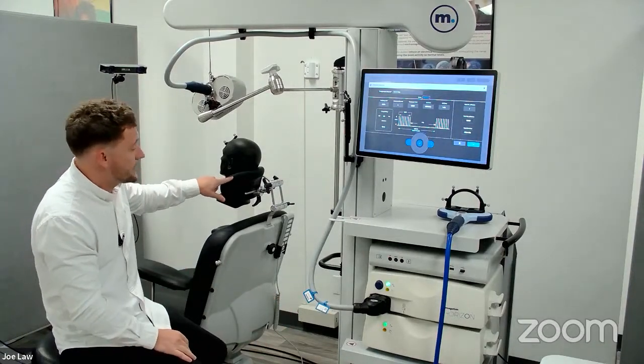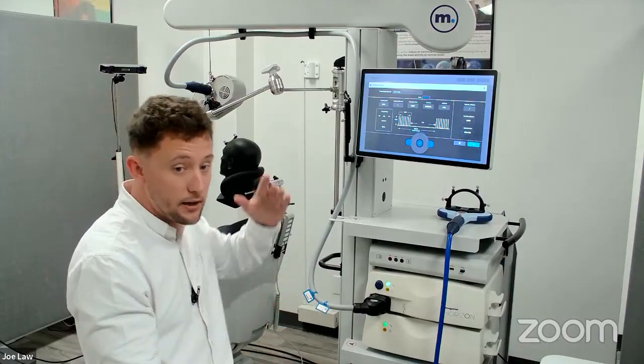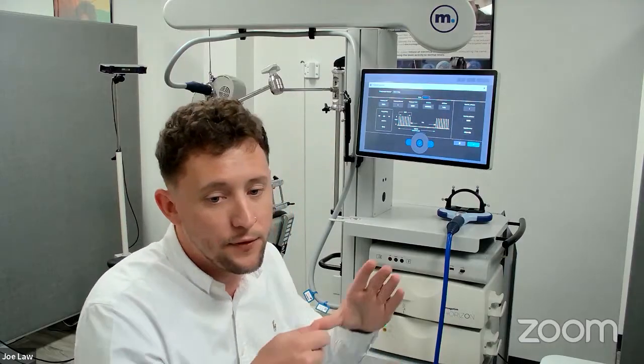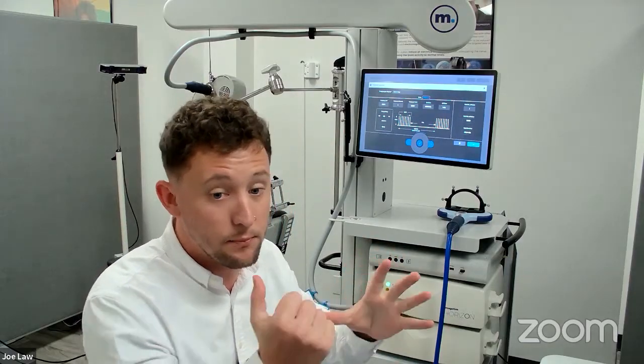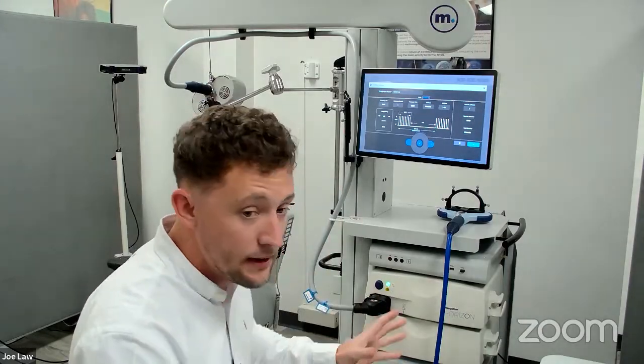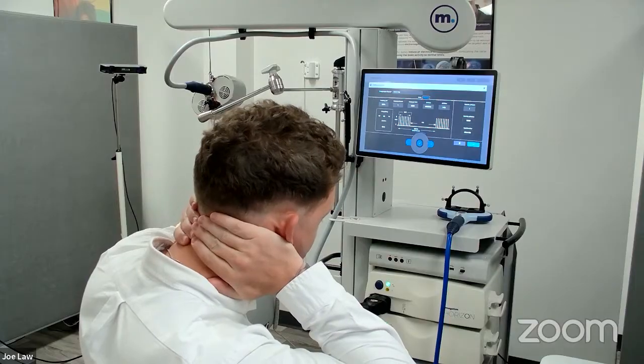We also have the Magstim headrest. I really like this headrest because it doesn't go the entire way up the patient's head, which makes it very difficult to do mappings, or even to place the coil on some off-label protocols. It's difficult to get to the patient's head if there's a headrest there. Ours is more like a bottom-of-the-head neck rest. It supports the patient's head like this.